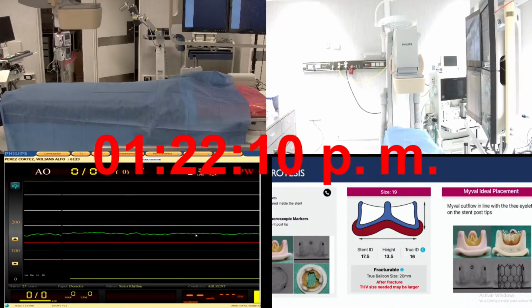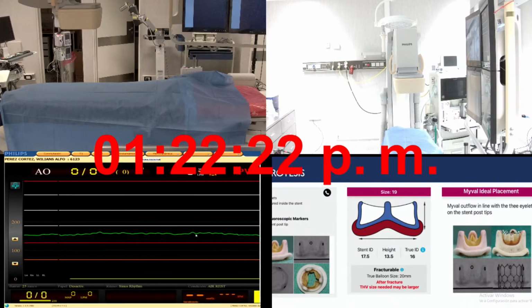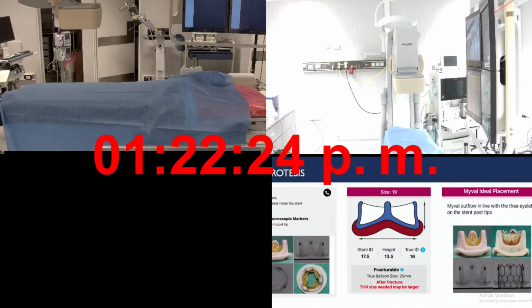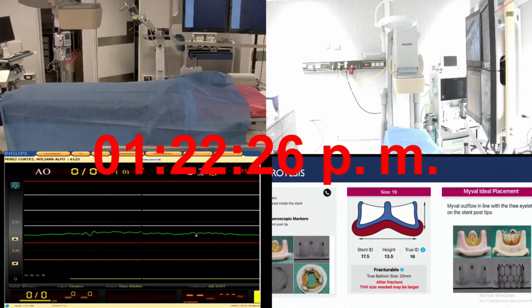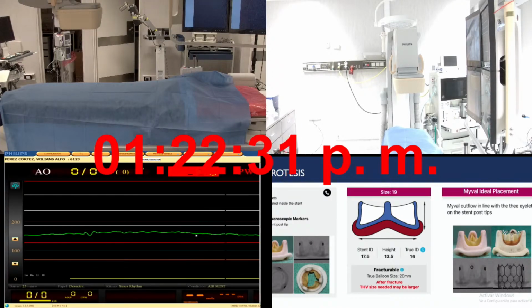Is there a specific role for other imaging techniques like NIRS in the future? I'm not sure that NIRS, I believe NIRS is not actually being actively commercialized any longer. I really think that the future probably is a combination of intravascular OCT and IVUS in some degree. Both have a big role in clinical practice. As I said, we're particularly interested in the role of OCT in ACS.